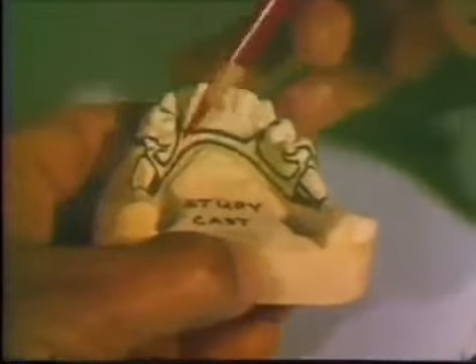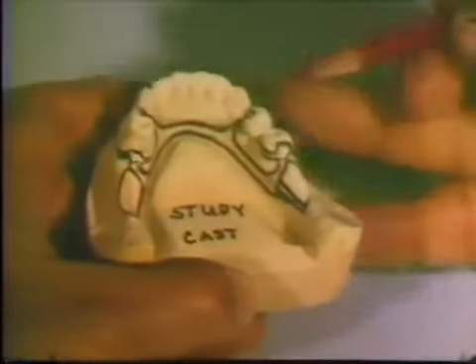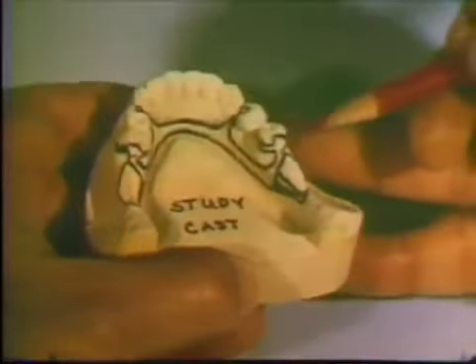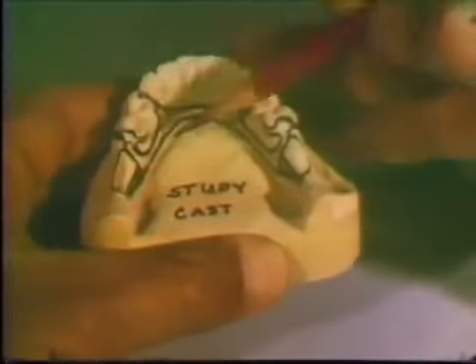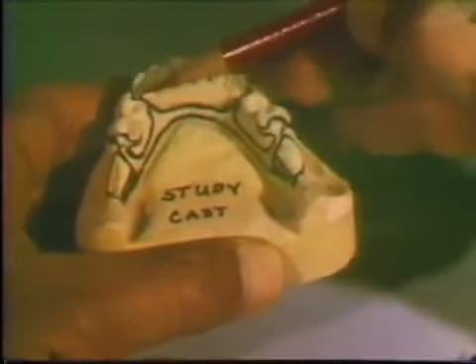Finally, a bilateral distal extension removable partial denture will be constructed to replace missing posterior teeth, support the occlusion, and restore lost function. The tentative design of the removable appliance includes lingual bar major connector, combination clasp direct retainers, rigid lingual reciprocal arms, resilient 18-gauge wrought retentive arms, and indirect retainers in the form of additional occlusal rests on teeth 22 and 28.